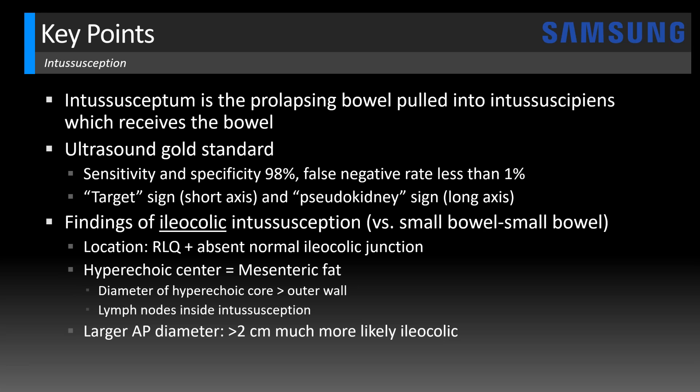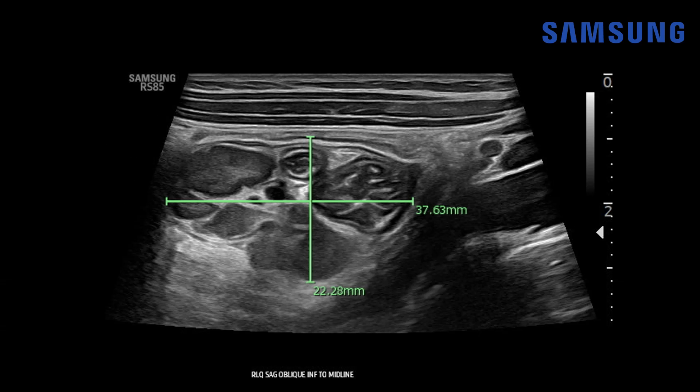Ileocolic also tends to have a larger AP diameter — greater than two centimeters is much more likely ileocolic — and a longer length greater than three centimeters. Looking back at our case, the AP dimension is 2.2 centimeters and the length is 3.8 centimeters. Very typical for an ileocolic intussusception.